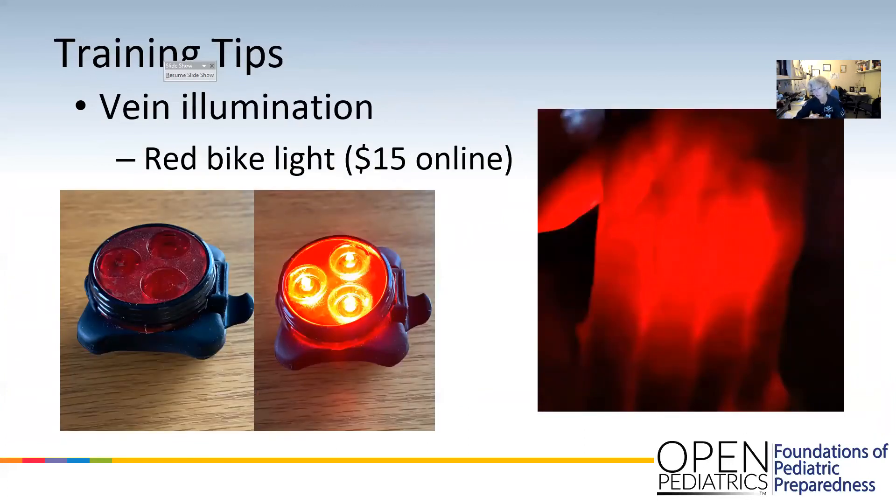We have something called a Transluminator Light. Those are hundreds of dollars. This is a bike light that I got on Amazon for about $15. It does not get hot. The picture where you can see the veins is actually my hand, so it glows through fairly thick tissue. It helps so you can see where valves are, if the vein is blown, or if it's an actual vein and what path it takes — if it starts to dive deep, if it's straight, if it branches off to the right. It's a very useful tool.